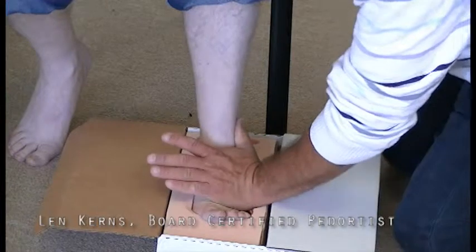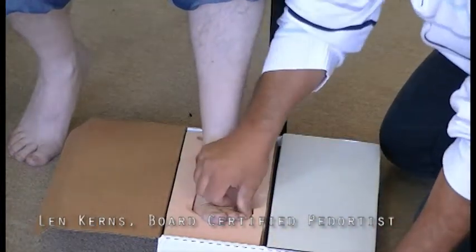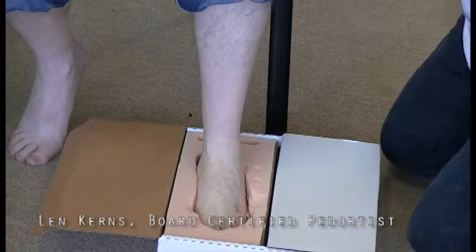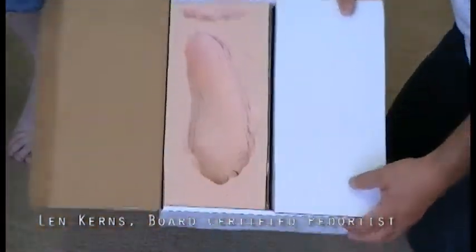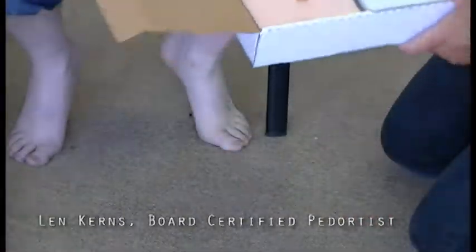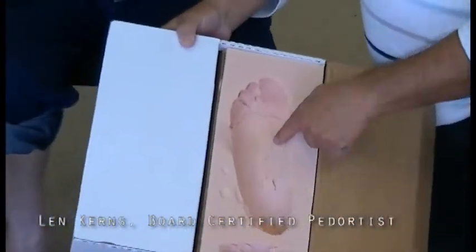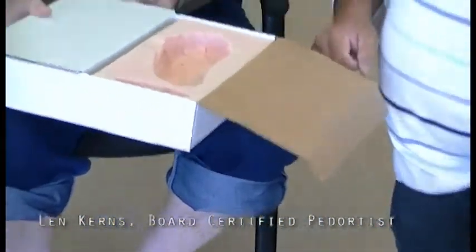So we've got that done. Now the foot's in position, and now I'm just going to gently push each toe into the foam box. And we're all set. And then he's going to lift this up, close the lid. First we'll demonstrate, let me turn this box around. And very important, you can see the arch that's made right here with the proper positioning of the box.